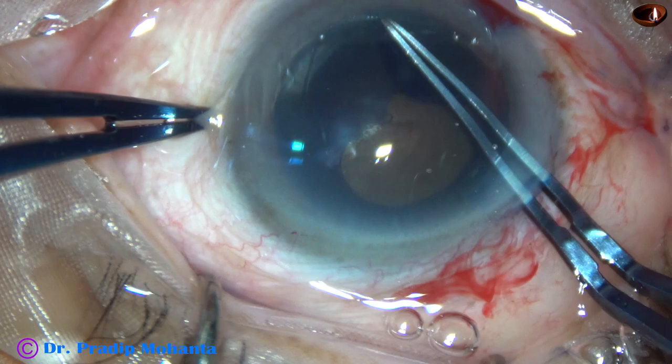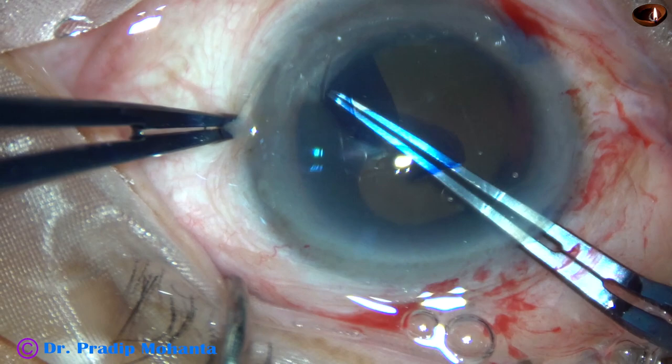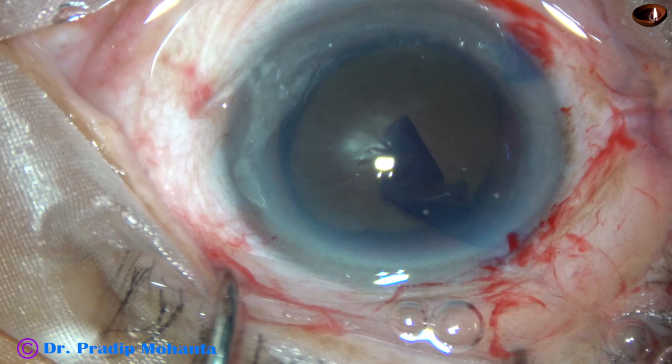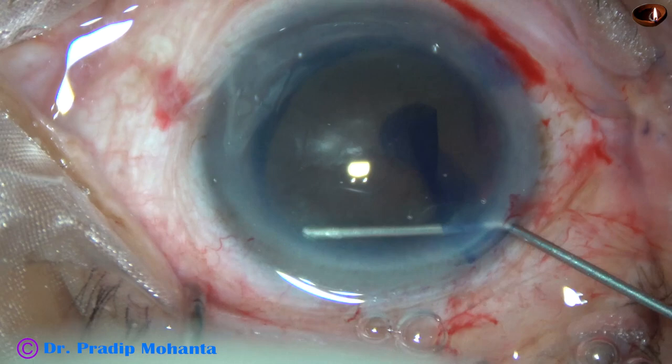The capsulorhexis has been started. The plan is to make a large rhexis — at least 6mm, maybe even 6.5mm. In this case, I believe the size of the rhexis is about 6.5mm in the 2 and 8 o'clock axis, and 6mm at the 5 o'clock, 11 o'clock axis. It is a kind of oval rhexis.